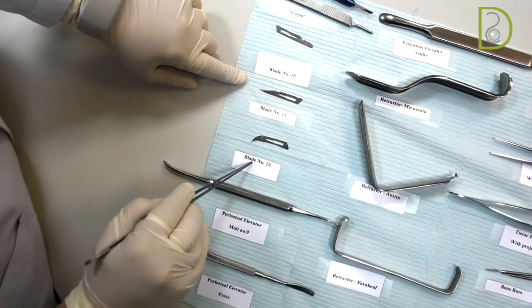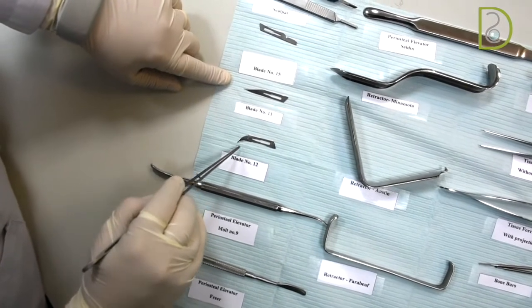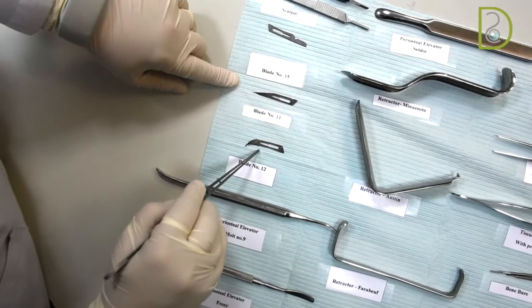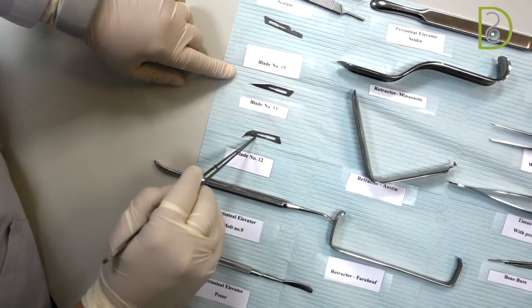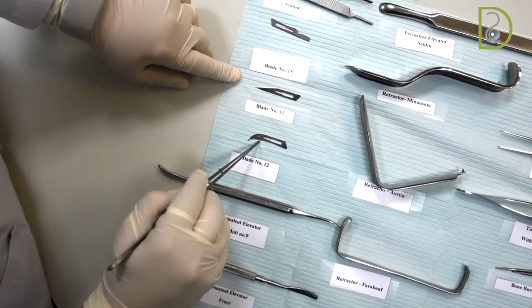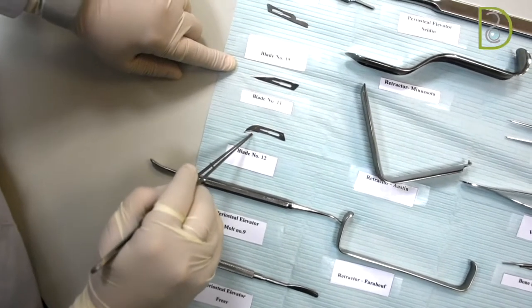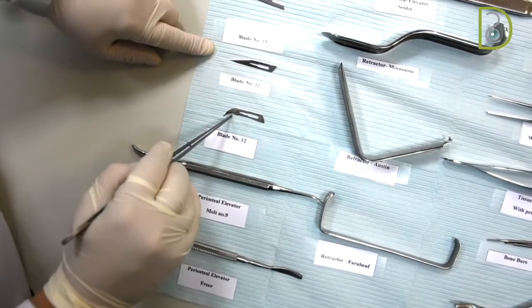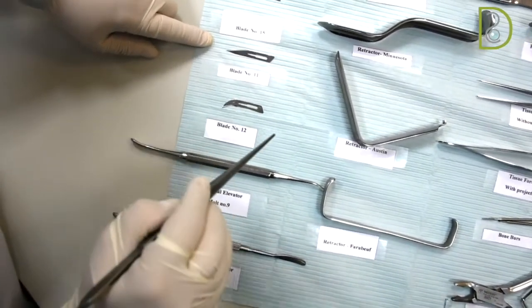Then coming to the blade number 12, as you can see, it looks like a number two here, sickle shaped, and this is to maneuver any distal areas or around the sulcus. As you can see, it's a semicircular shape. So if we are looking around the sulcus of teeth, it will match it. Or if I want to reach the most distal area, which is the tuberosity area in the maxilla, this is your blade of choice.